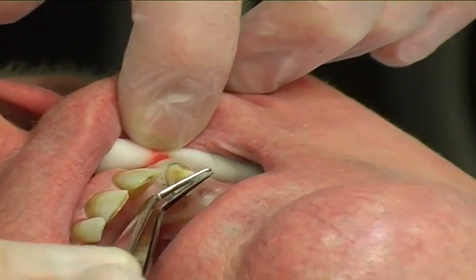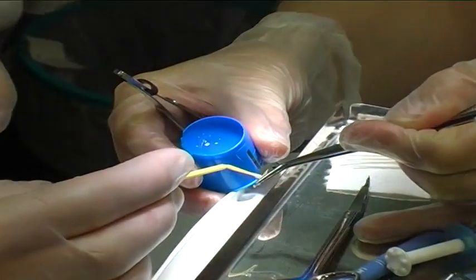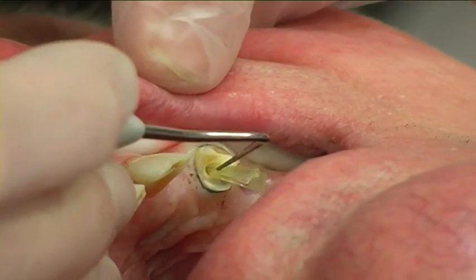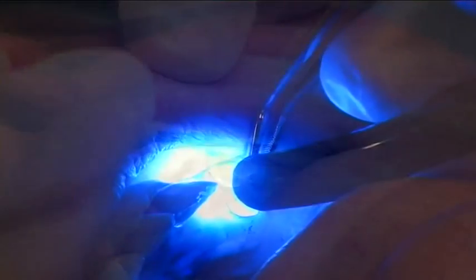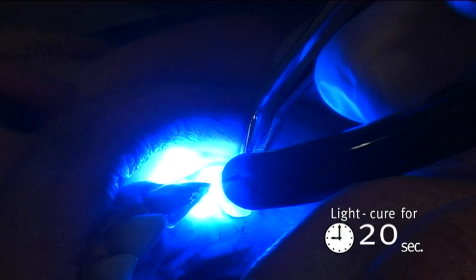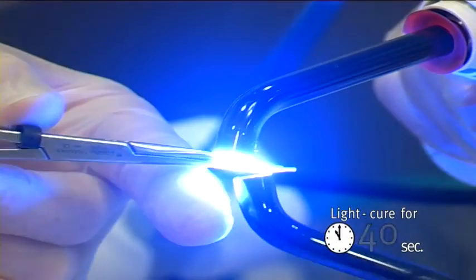The post was fitted inside the root canal. An additional post was shaped and attached to the main post coronally with a thin layer of enamel resin to increase the strength of the coronal part. The shaped post was light cured for 20 seconds inside the canal, then removed and light cured on all sides for 40 seconds.